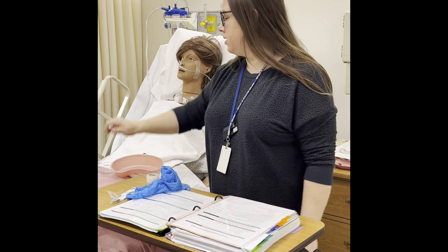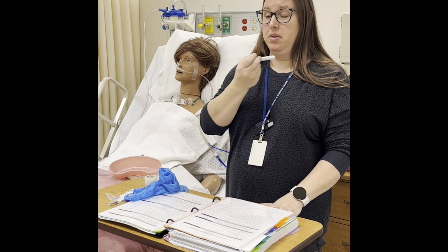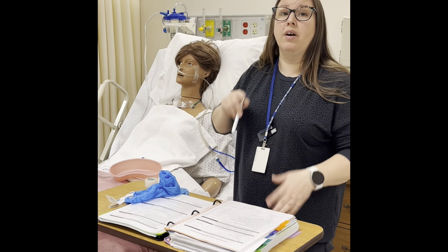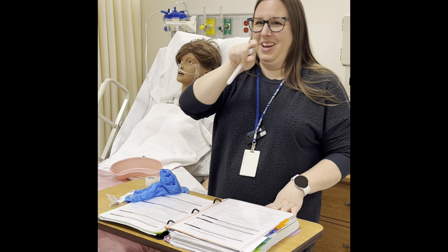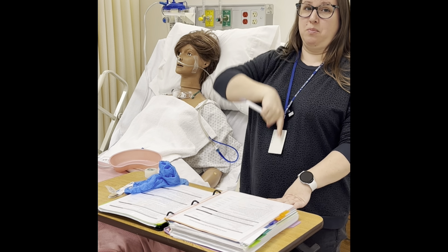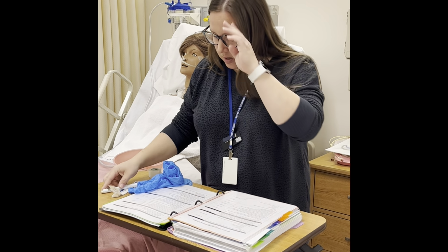What we want to do is use the pen light to see, is the tube coiled inside somebody's mouth? You're probably not going to get to 54 or 52 centimeters with it coiled. It will probably cough and the tube will come out their mouth. I always say it's like a snake popping out. It will come right out. What you have to do is pull it back till you get to that gag reflex again and reinsert it. All of this is clean, none of this is sterile.